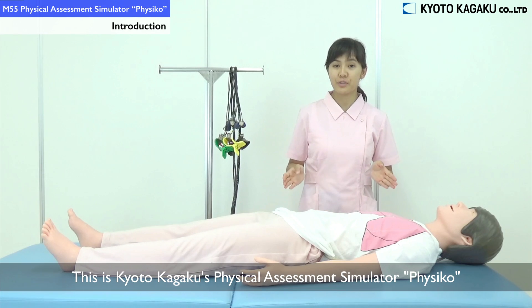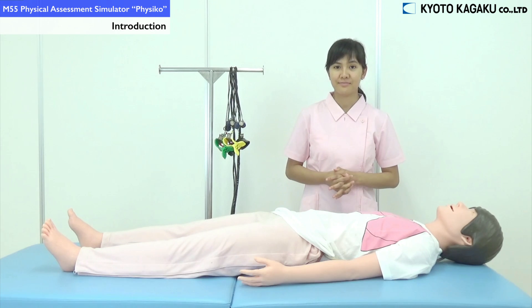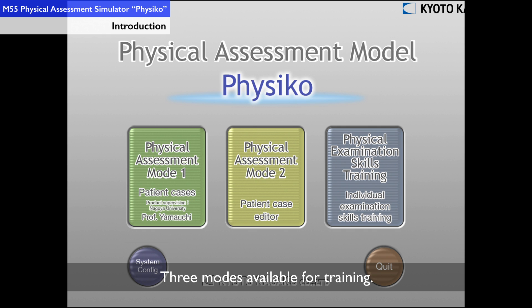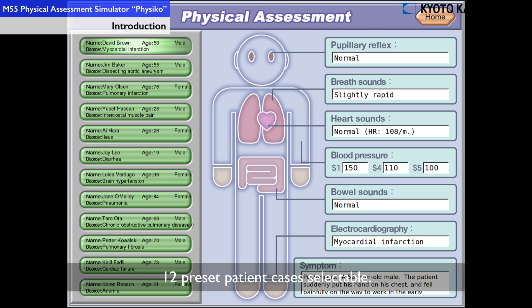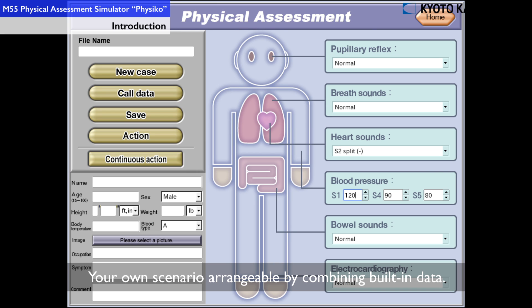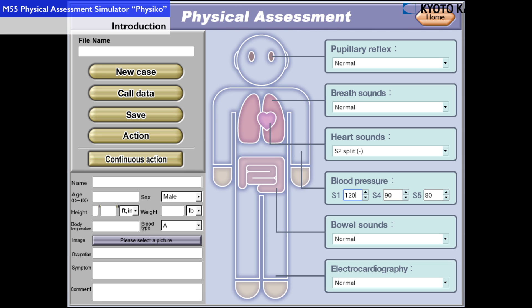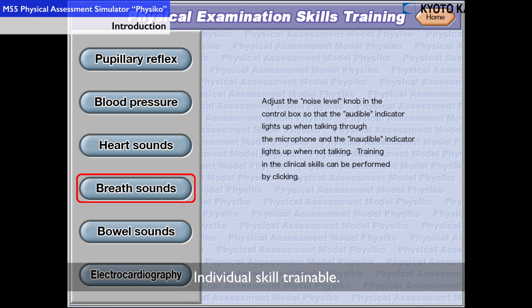This is a model used for training physical examination skills. There are three modes available for training. You could choose from a selection of 12 different patient cases. You could arrange and combine available data to create your own scenario. Use the physical examination skills training mode to train each skill individually.